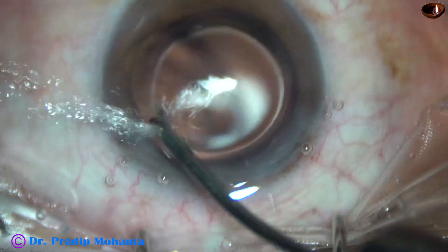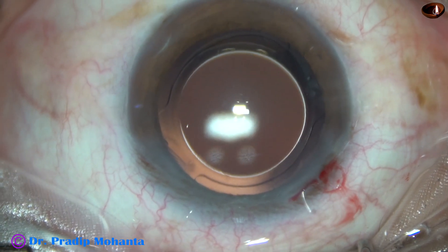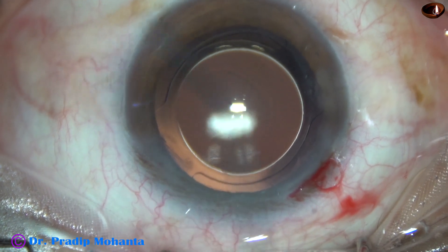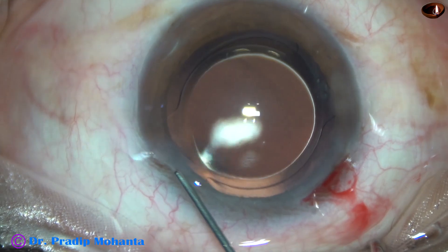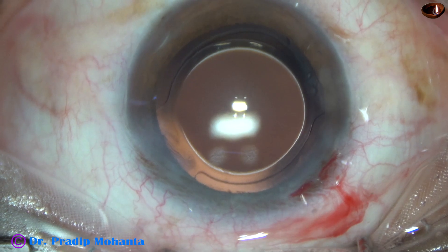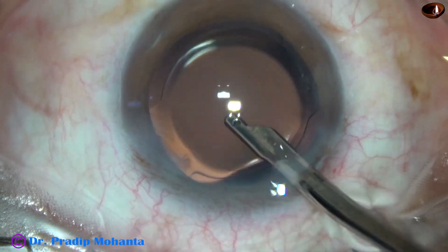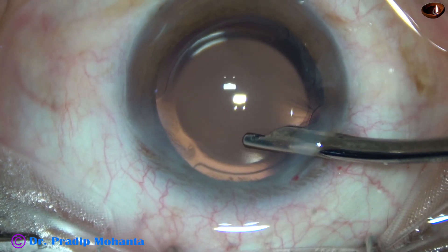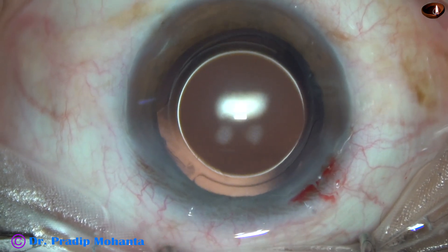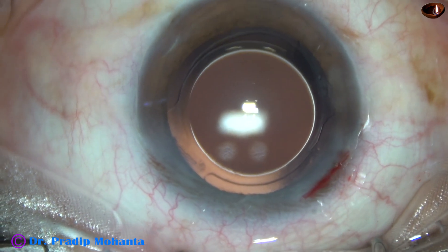Here, towards the end of the surgery, I inject a bit of moxifloxacin. Then I close the side port by corneal stromal hydration. The main wound is constructed in such a way that it will not require any hydration. This is the final lavage of the anterior chamber. The anterior chamber is nicely formed and the case is concluded. The integrity of all the wounds are checked — both the main wound and the side port.